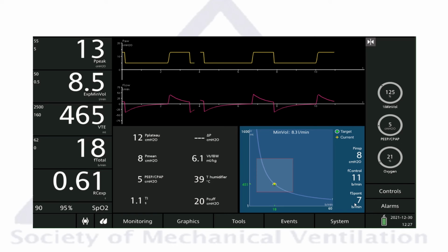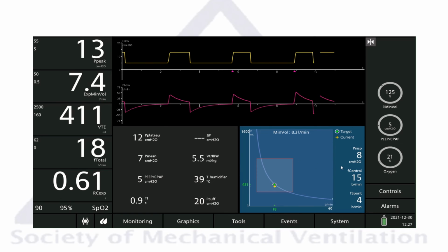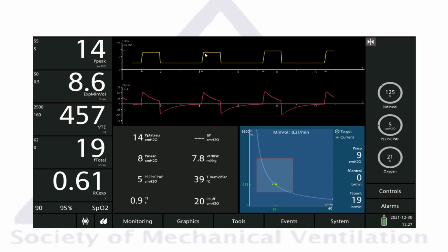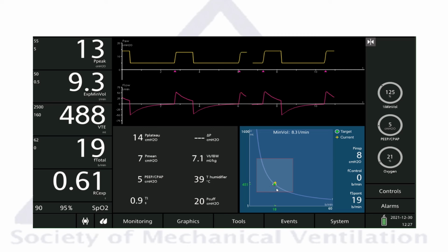So this means by definition it is an IMV mode right now because the patient is partially doing some of the work. The only difference in ASV is now you don't dial a certain pressure support like you do with the regular SIMV, because the ventilator will control the spontaneous breath, to control the pressure, try to achieve the tidal volume.